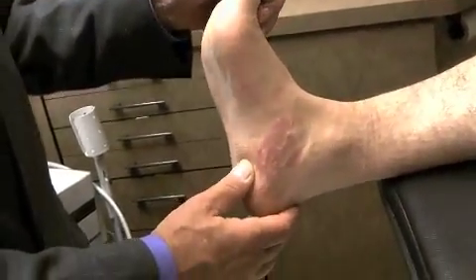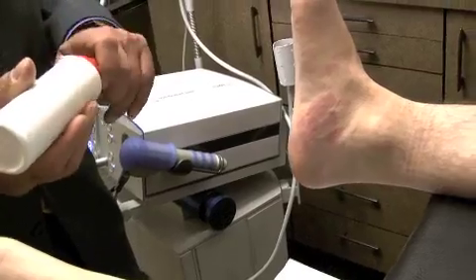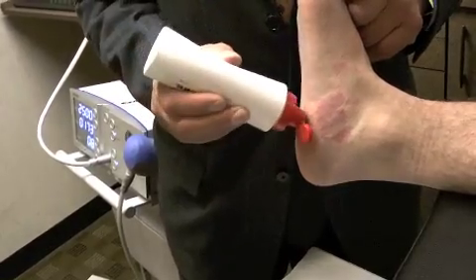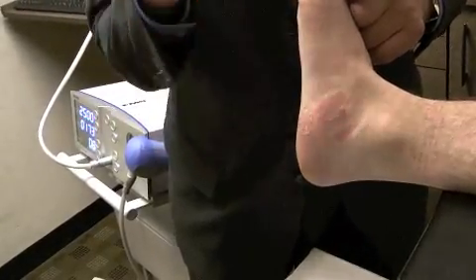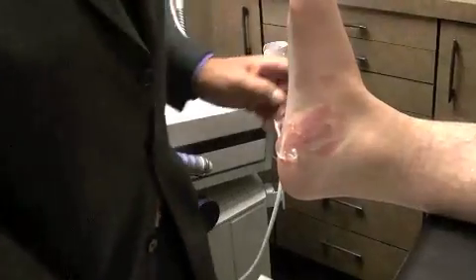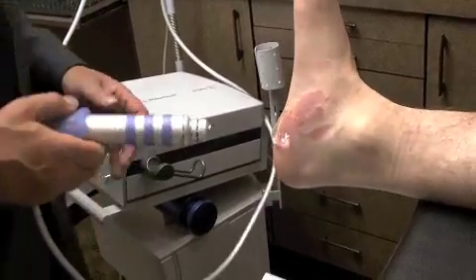Okay, now we're going to go to a typical patient here that has plantar fasciitis on the plantar aspect of his heel, typically in this area. The first thing we want to do is put some gel on it, just like we would be using ultrasound. This will give us better contact for the shockwave unit. This stuff starts to splatter a little bit, so I suggest you have a Kleenex handy so you don't get splattered all over the place.